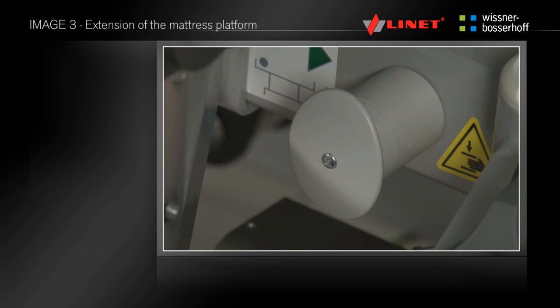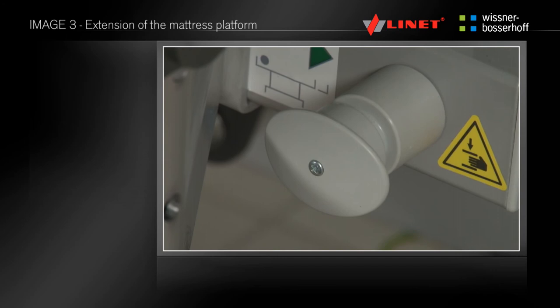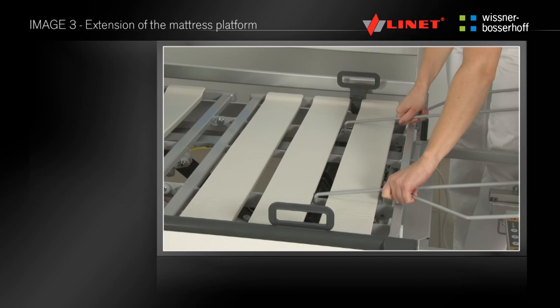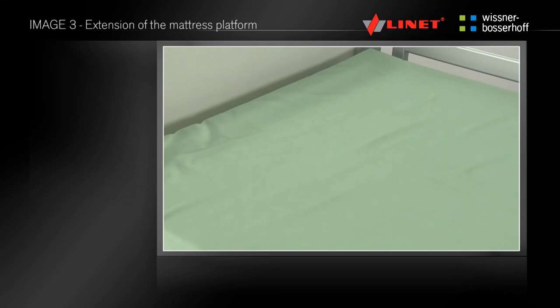Extension of the mattress platform can be done by sliding the foot rail. Unlock the locks by pulling and turning 90 degrees on both sides of the bed, then extend the mattress platform by pulling it towards you. Place the locks into the original position. Lift the mattress and slide the mattress bracket to fill the gap, slide the mattress towards the foot end, and place the mattress extension into the gap at the head end.